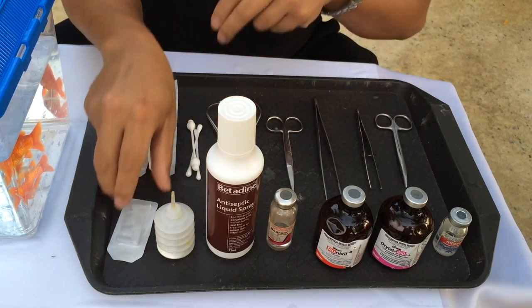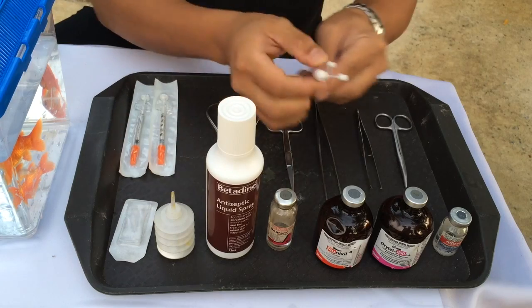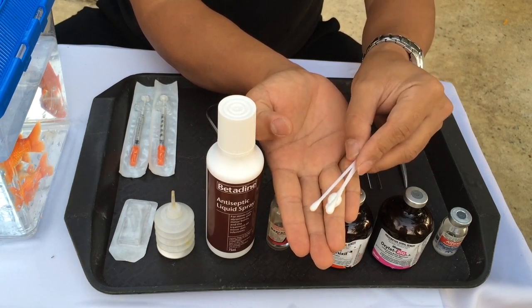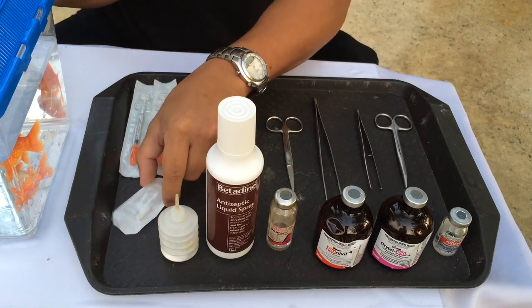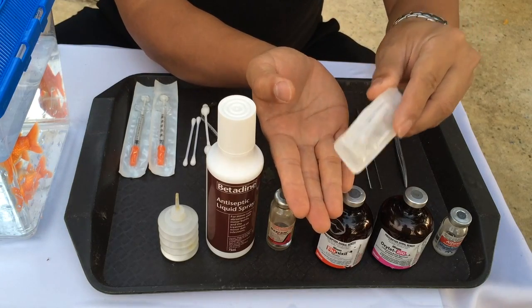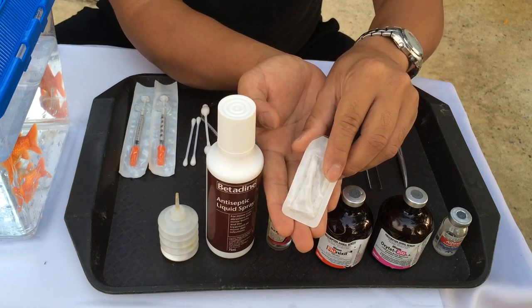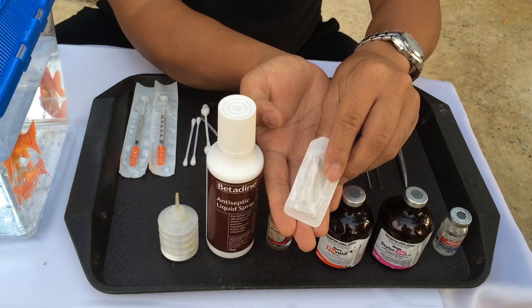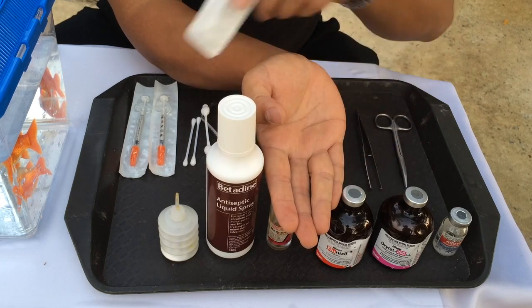If the eye bleeds too much, we have cotton swabs to apply digital pressure onto the socket. We can also use phenylephrine hydrochloride, which helps to constrict blood vessels if it bleeds too much.